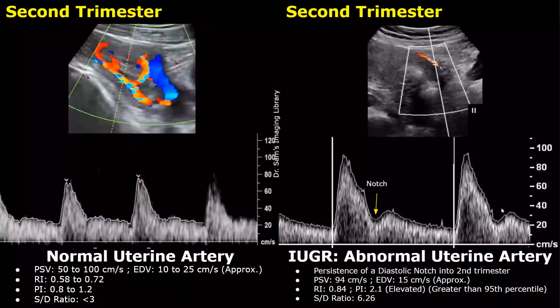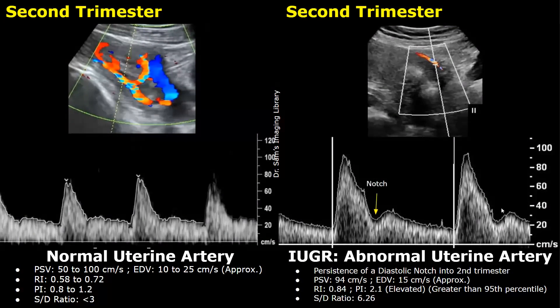Uterine artery Doppler findings can also indicate IUGR, especially in the second trimester. A notch seen during diastole in the uterine artery waveform in the second trimester can be a sign of IUGR — this groove should not be present and is not seen in a normal uterine artery. Another key parameter is pulsatility index; the normal PI is 0.8 to 1.2. In this abnormal uterine artery example, the PI was 2.1, which is elevated and greater than the 95th percentile.